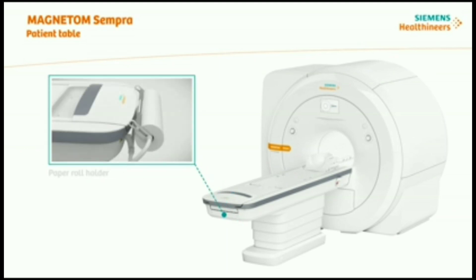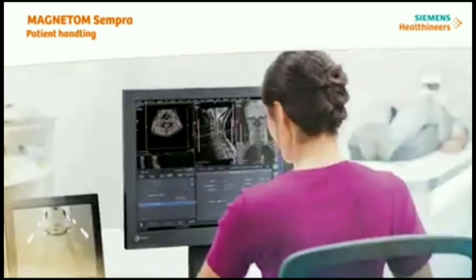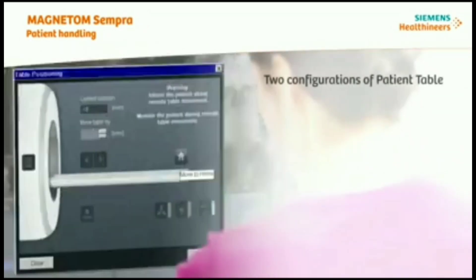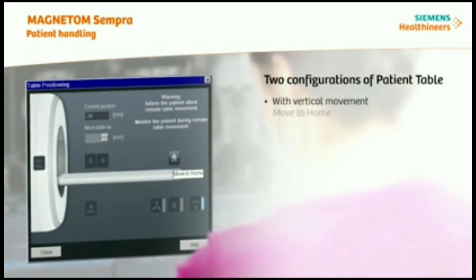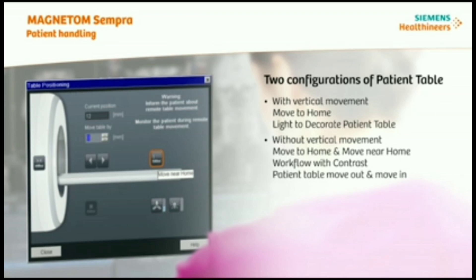There are two configurations of patient table for Magnetom Sempra available: with and without vertical movement, in addition to the horizontal movement. With vertical movement, press the move-to-home button for patient table movement. Without vertical movement, check the move-to-home and move-near-home buttons. The move-near-home button is implemented for non-vertical movement patient tables only — for example, for workflow with contrast, so the patient table moves out and back in for better workflow. Just press the move-near-home button.